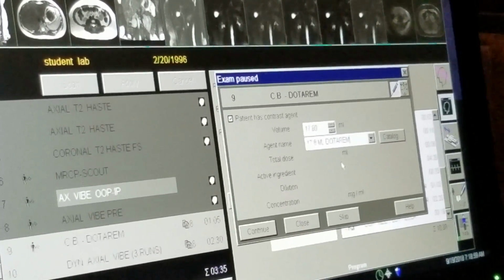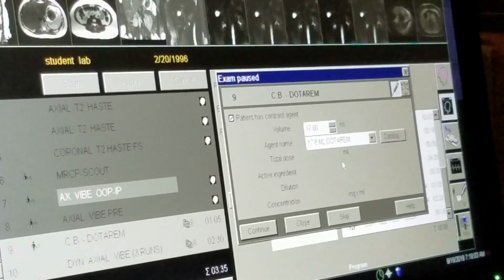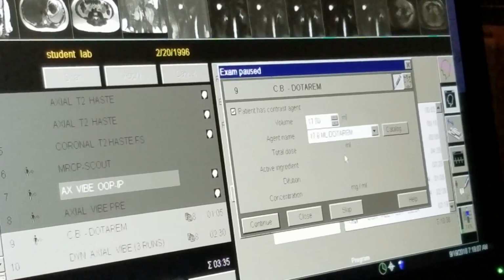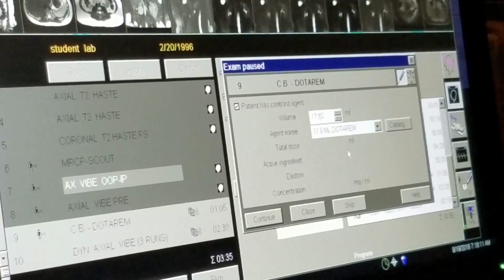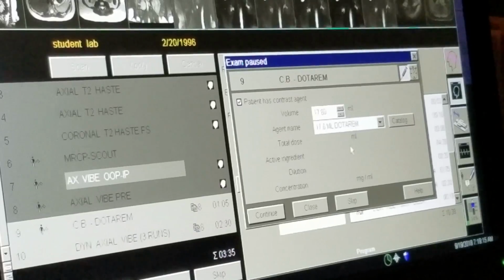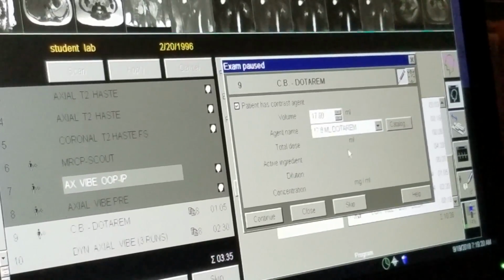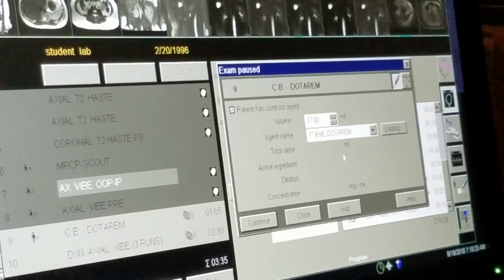So I give the same delivery every time because a lot of times the patients are used to me saying take a breath in and hold it, and then they hear the noise. If you don't mention that, I've seen it with other people where the scan starts, the patient panics, they thought they should have held their breath, then they squeeze the ball, and then you think something's wrong, but they're just asking you, should I have held my breath? So just be as clear in communicating with your patient as you possibly can be ahead of time so they know exactly what to expect.